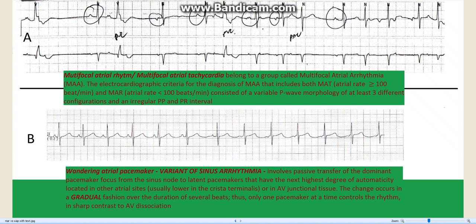A wandering atrial pacemaker is difficult to catch on your regular 12-lead or random 12-lead EKG and even on telemetry. I often say this occurs when the patient is sleeping, and you need to observe the telemetry strip for a longer period of time so that you can appreciate the gradual change of P wave morphology.